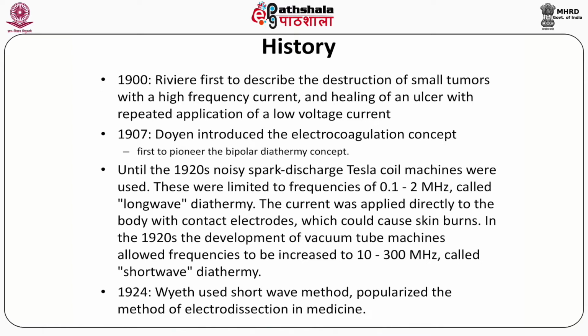Until the 1920s, noisy spark discharge Tesla coil machines were used. These were limited to frequencies of 0.1 to 2 MHz, and these were called long wave diathermy. The current was applied directly to the body with contact electrodes, which could cause skin burns.